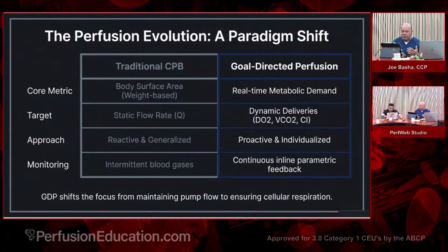And then it would be really nice if we could have truly simplified, continuous inline parameters and feedback of what we are doing. We've tried this with the CDI. We've tried this with a variety of different devices. I know we have continuous SVO2 and hemoglobin monitoring. I think the Essence has that. Essence has more, apparently. It can do almost like CDI, can't it? No, it can't quite do CDI.